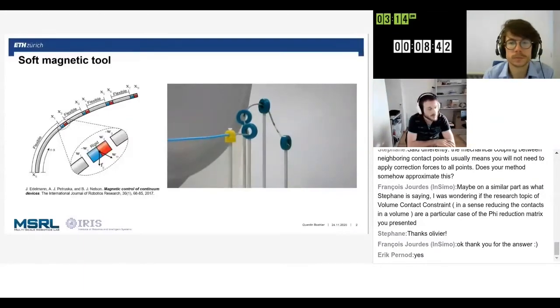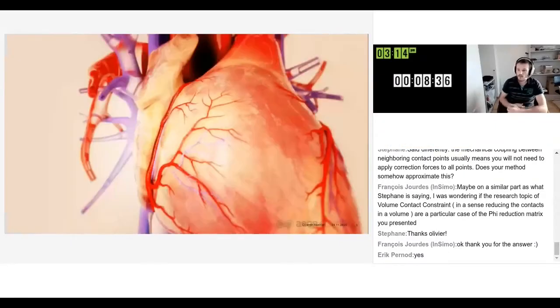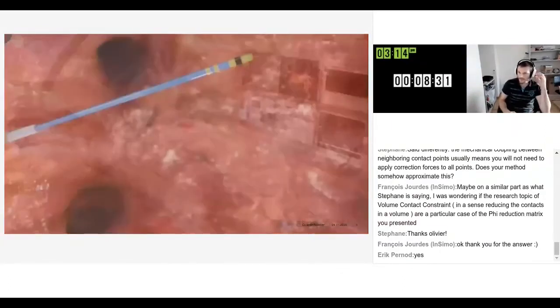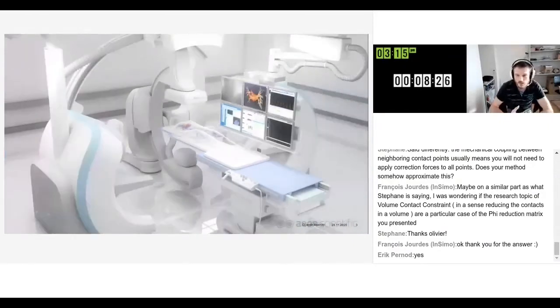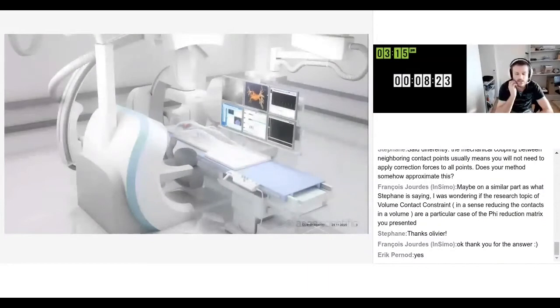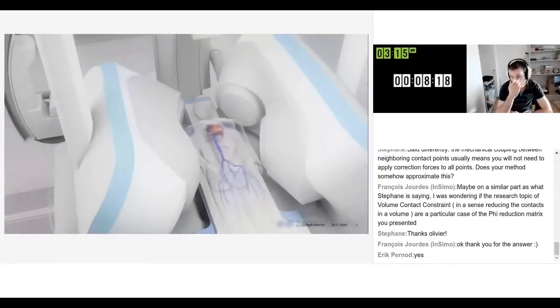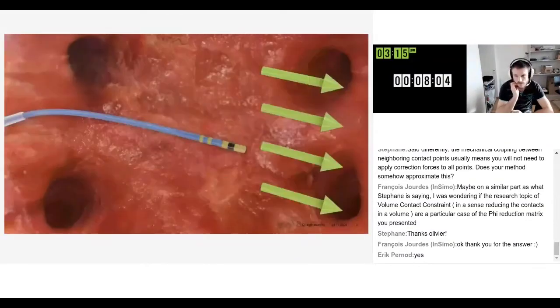Our group has more than 15 years of experience with this technology. The most noticeable milestone was back in 2010. We have a spin-off company called Aeon Scientific, which developed a clinical magnetic navigation system, essentially a machine used to generate these magnetic fields to steer magnetic catheters, in that case to treat cardiac arrhythmias. This demonstrated at the time that the technology could be used for clinically relevant tasks and ultimately propose a viable alternative to standard manual tools, with increased safety thanks to the actuation method.